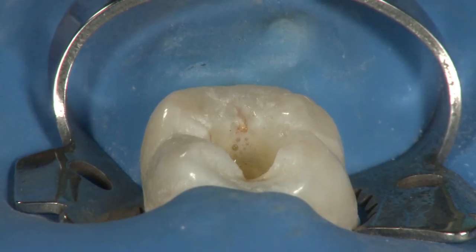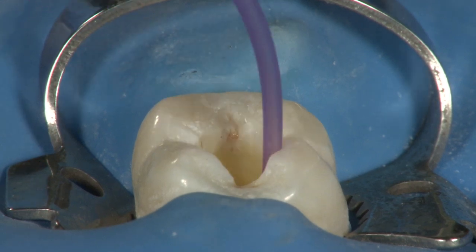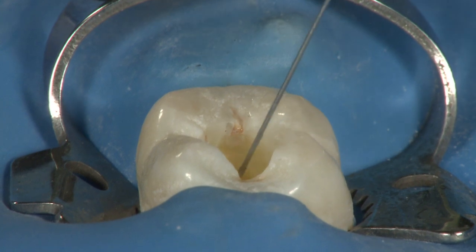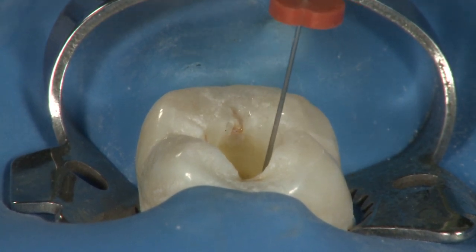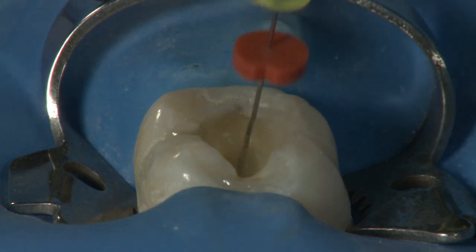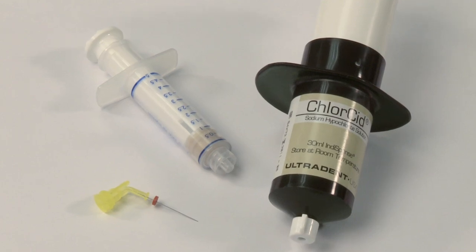Once you have finished instrumenting the middle third of the canal, evacuate the canal with a capillary tip and a luer vacuum adapter, then fill the canal with ChlorCid once again. It is not necessary to use more File-Eze, as ChlorCid will provide enough lubrication to finish the procedure.